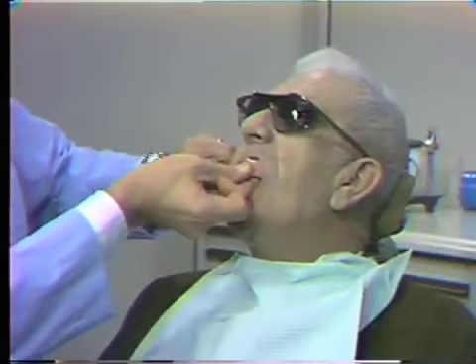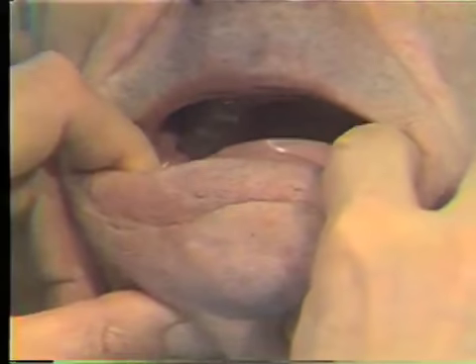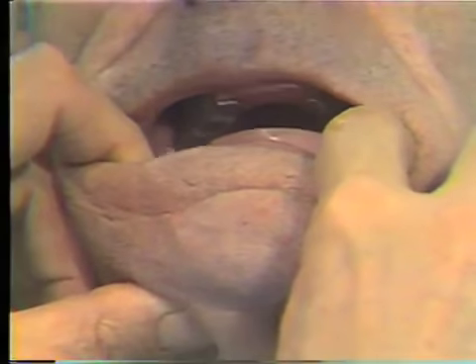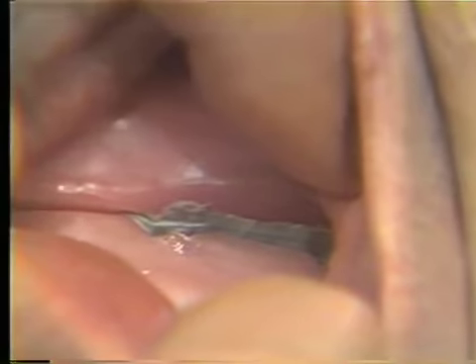And now once more. And again, Mr. Monahan, just close in centric, just close with your jaw relaxed, close into tight contact. Now, I think you can see how nicely the wax fits into the grooves. It's exactly flush, in other words, he is contacting in exactly the same position as he did before. Over this way, Mr. Monahan, and you can see the same situation on this side.